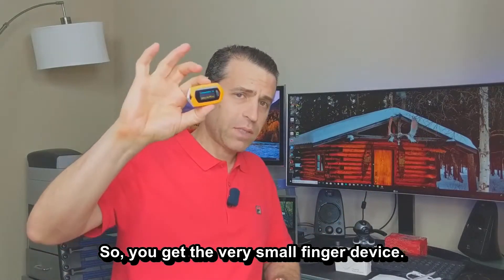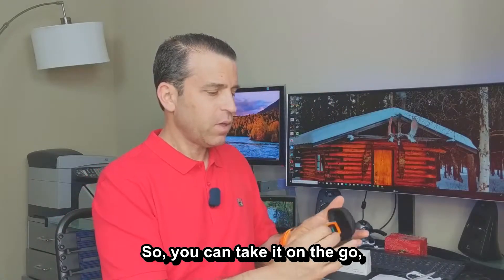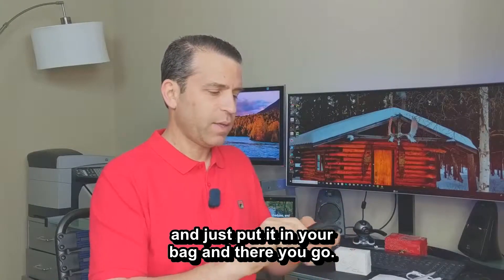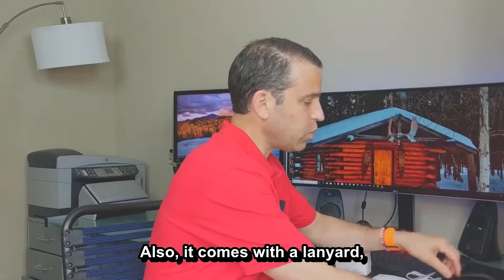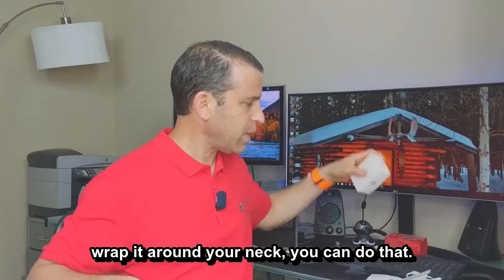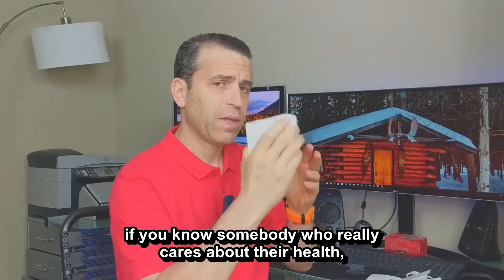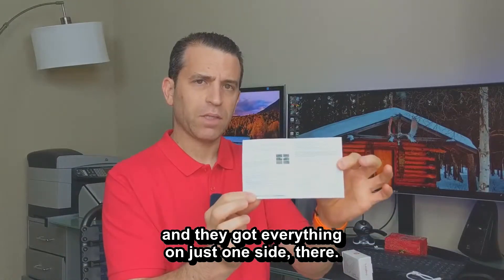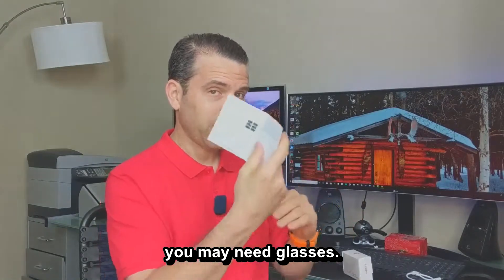You get this very small finger device, and what's nice is it comes with a case, so you can take it on the go, keep it protected, and just put it in your bag. It also comes with a lanyard — if you want to wrap it around your neck, you can do that. The packaging is a nice little gift box, so if you know someone who cares about their health, this would be a great gift. It also includes an instruction sheet with everything on just one side, so depending on your vision you may need glasses.